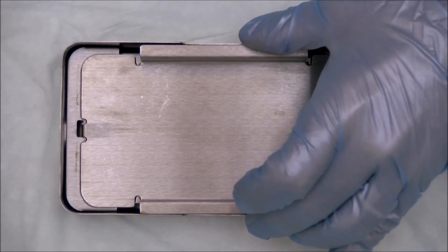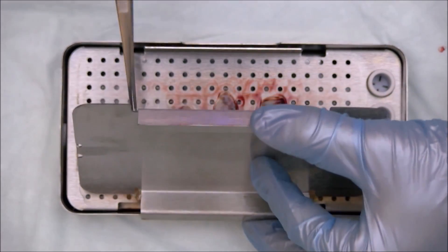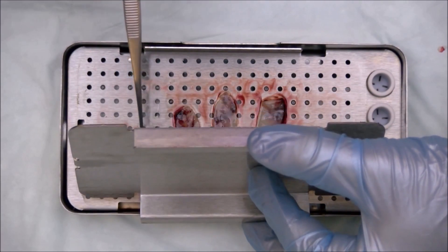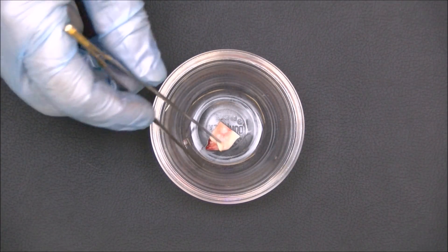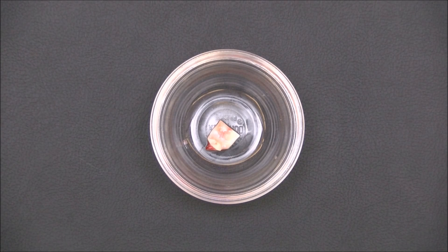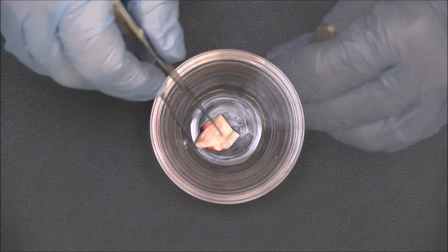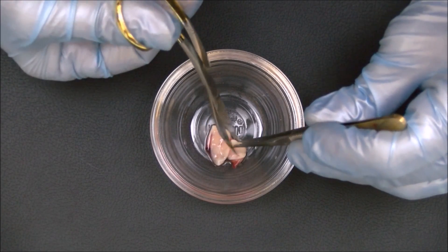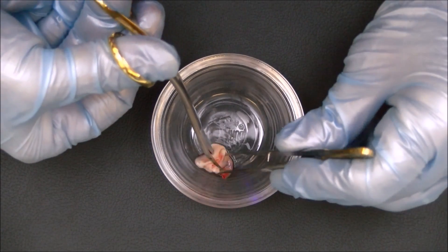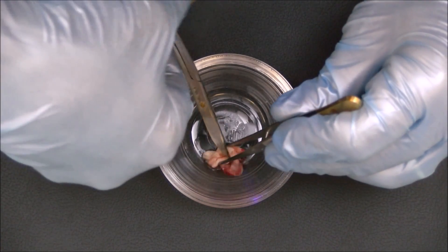PRF clots are then placed into the expression box, and the PRF membranes are created. Some of the membranes are then delivered to a sterile dappen dish. The membranes are then cut into small pieces. This will allow more even distribution of the PRF within the graft material.